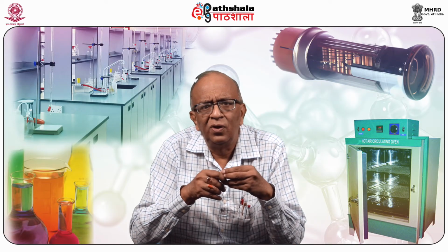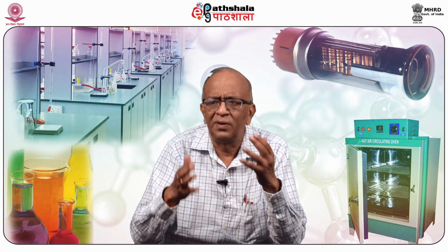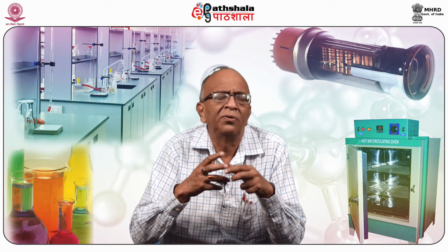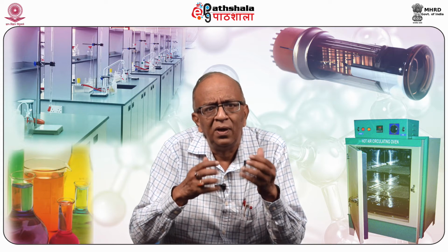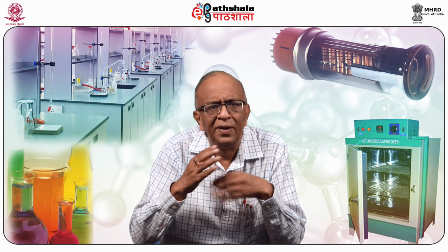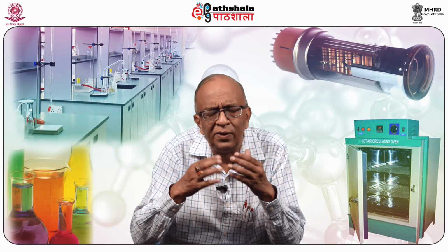Automatic analyzers earlier were designed for repeated analysis of the samples so that a number of samples can be done in a very small period of time. These instruments duplicate as exactly as possible volumetric titration procedures used by practicing analysts. Repeated cycles of operation with a single reaction vessel is very time consuming.